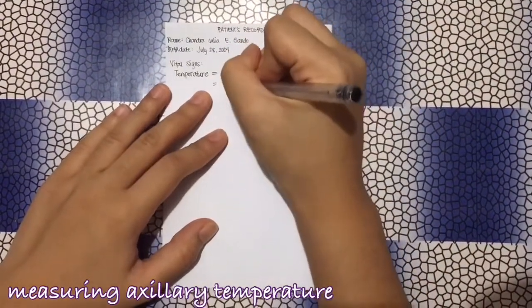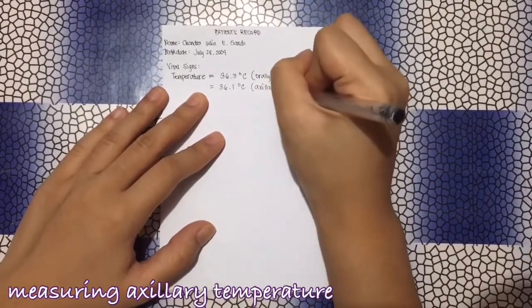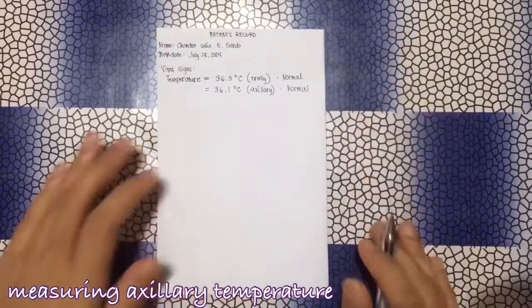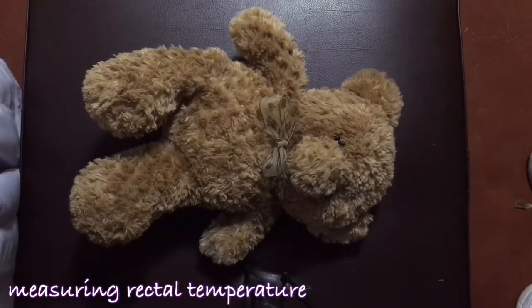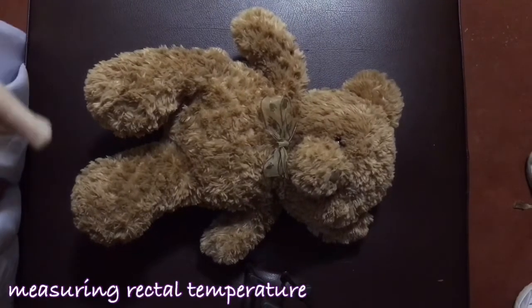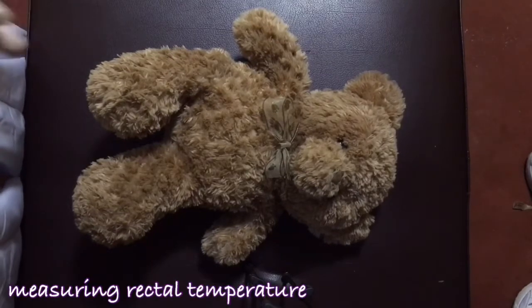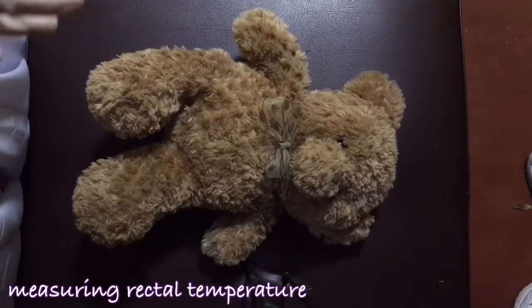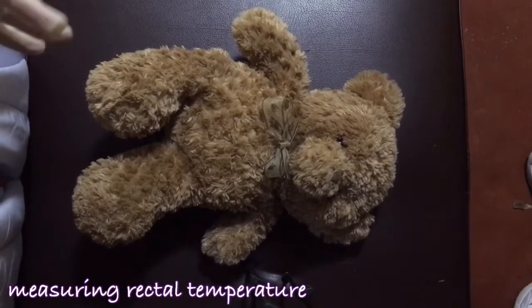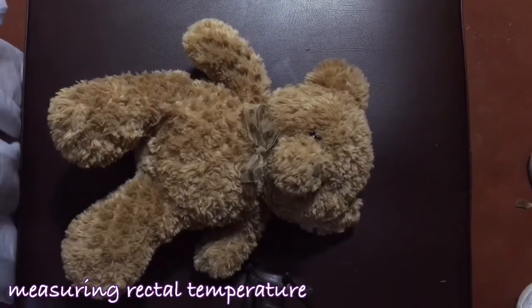V Report. I will measure the patient's temperature rectally because he is unconscious and unable to participate. I had already introduced myself to the patient's family, verified the patient's identity through his family, explained what I'm going to do and gained consent, performed hand hygiene, put on gloves, and cleaned the thermometer.